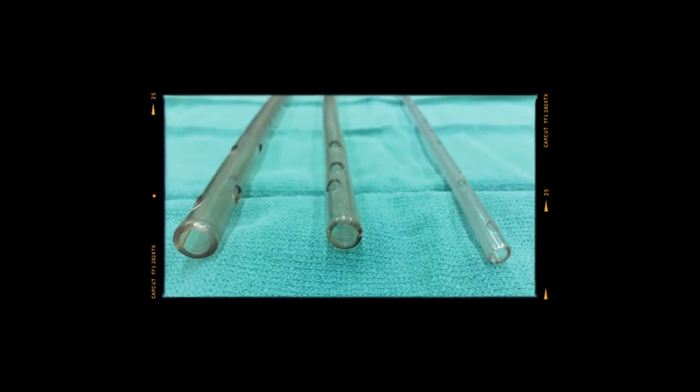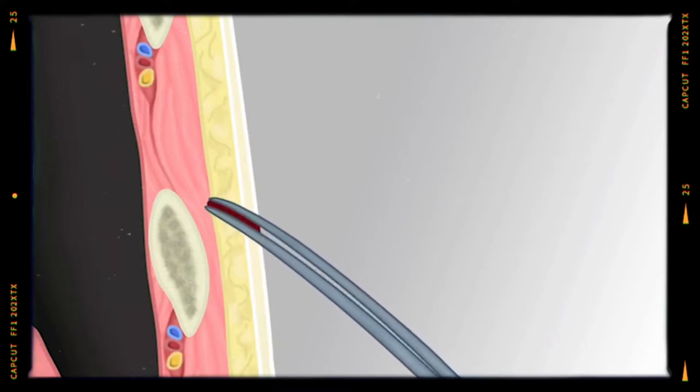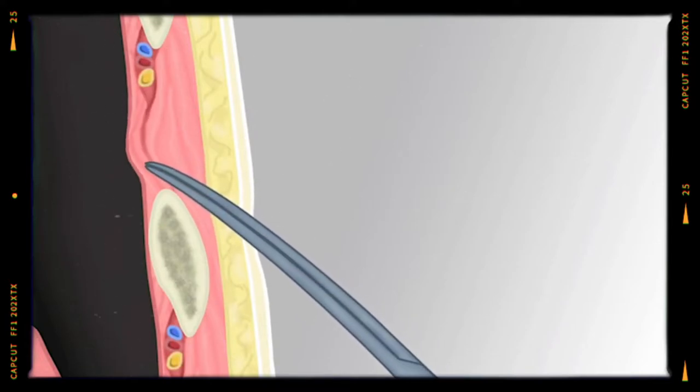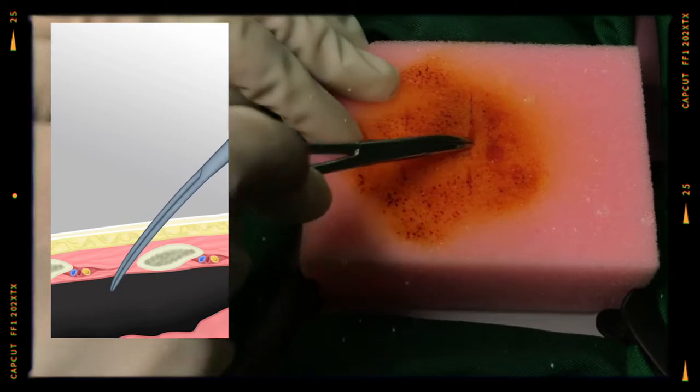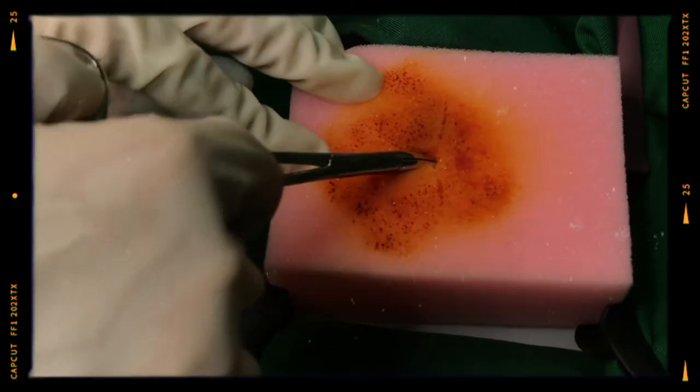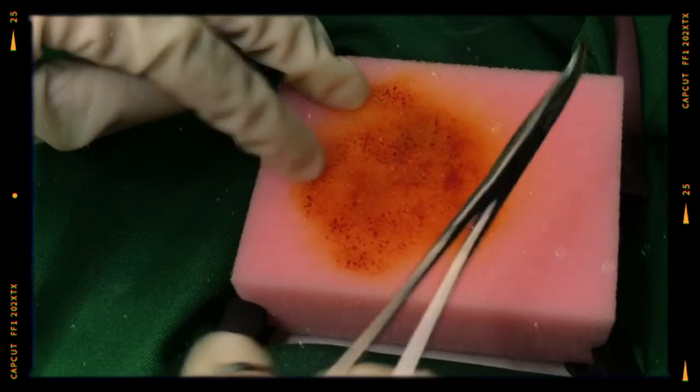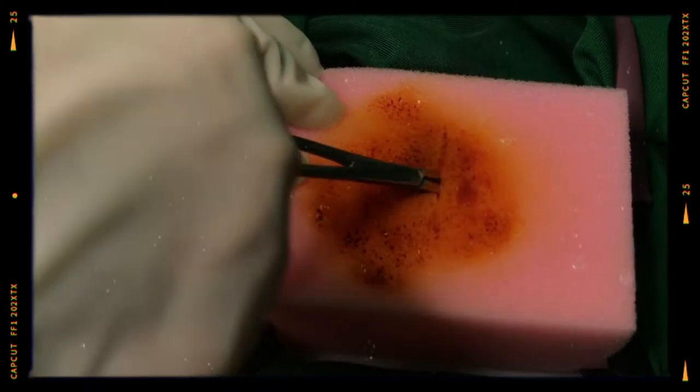Insertion site should be as close as to the upper border of the rib to minimize injury to the nerves and vessels. Insert a curved mayo scissors or curved kelly clamp and cut or separate the tissues to create a tunnel or track in the direction in which the tube is to be inserted.